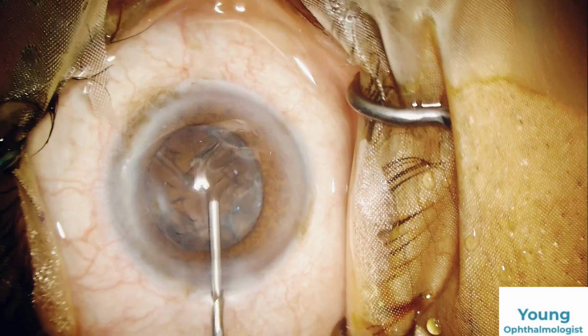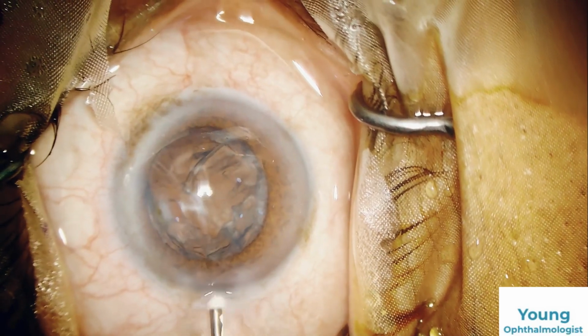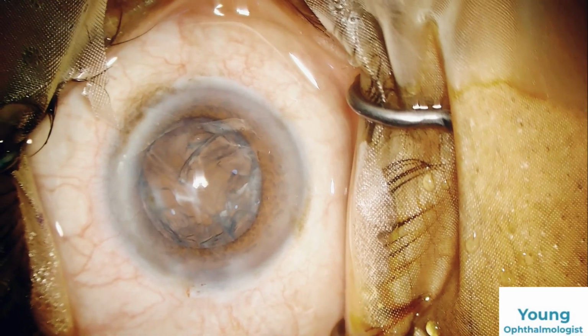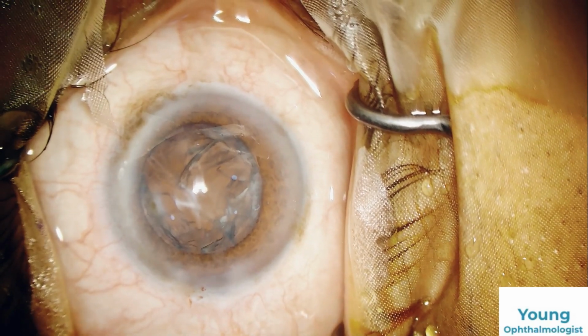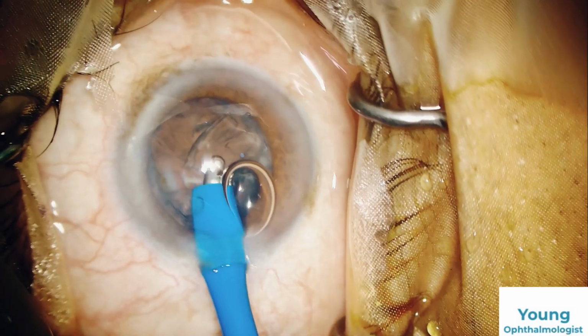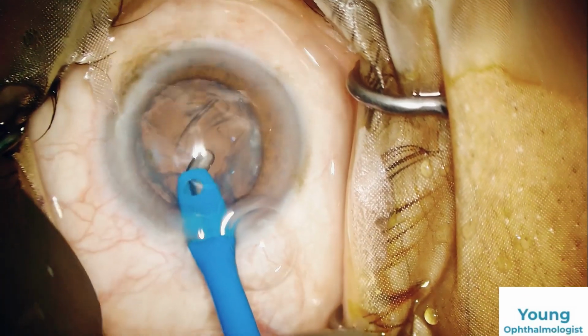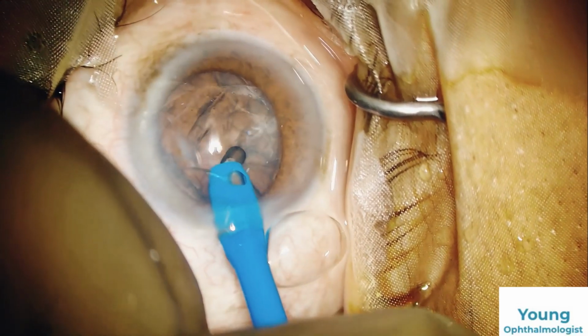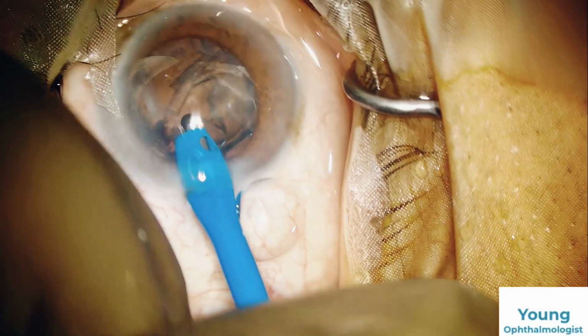Now pushing some visco inside the eye. Now we will be moving towards the cortical and epinuclear wash with the help of the coaxial. We will aspirate the remaining epinucleus and cortex. Now it will be very easy.